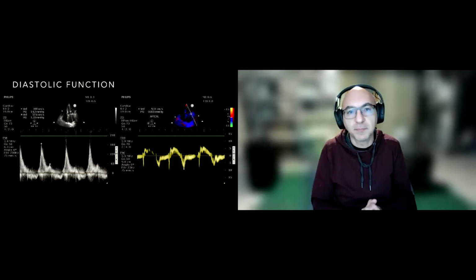So let me just throw in a little clinical scenario, just make something up here. We have a patient who's got pulmonary edema, who has, let's say, a creatinine of 1.8. We don't want to make it too severe, so they've got some kidney dysfunction. Maybe their baseline is 1.2, so a little bit of a bump above baseline. And their pressures are tenuous, 90s over 50s or 60s, we'll say a MAP that's 66. And they're dyspneic like this.